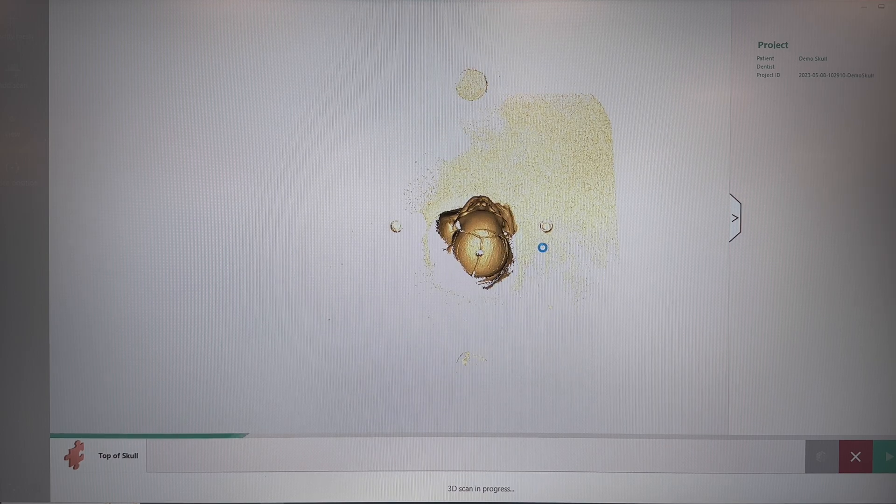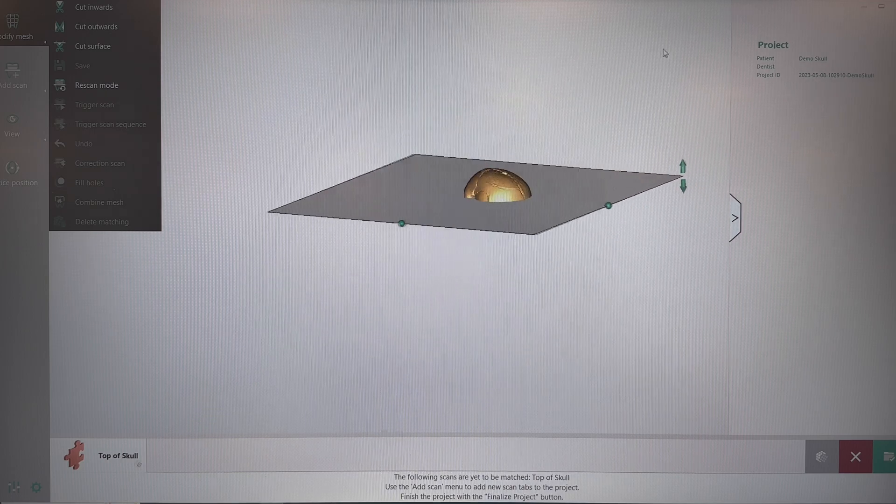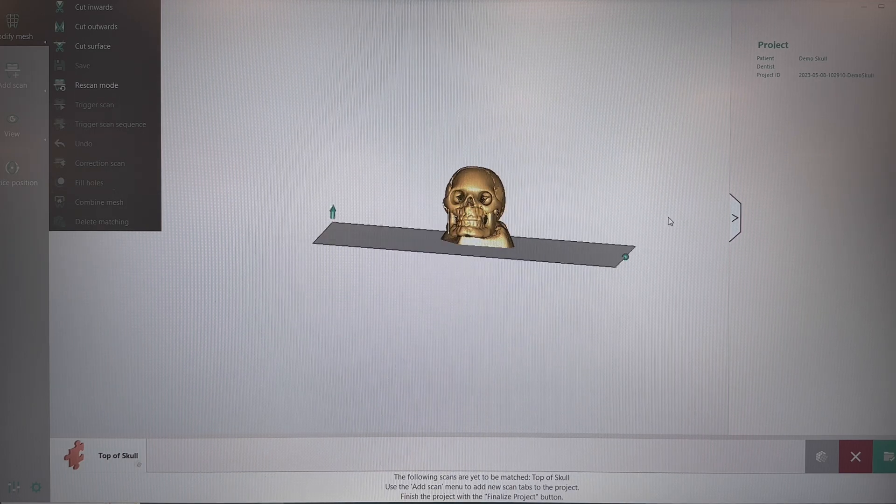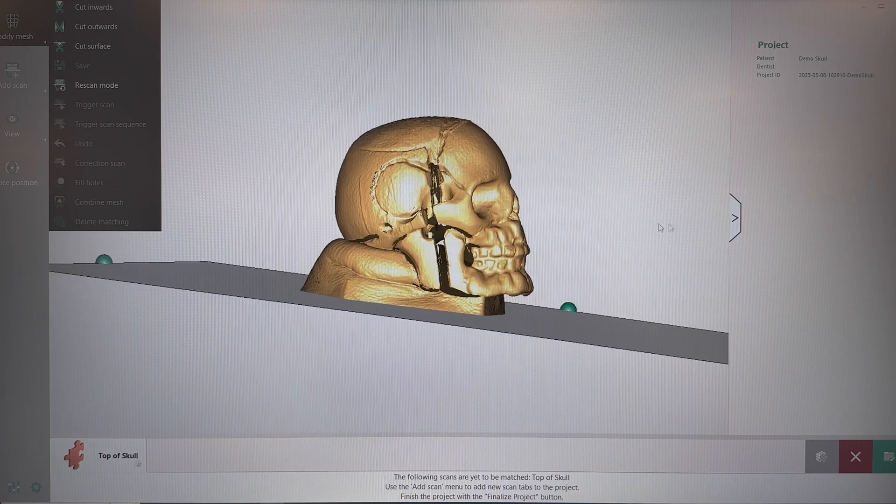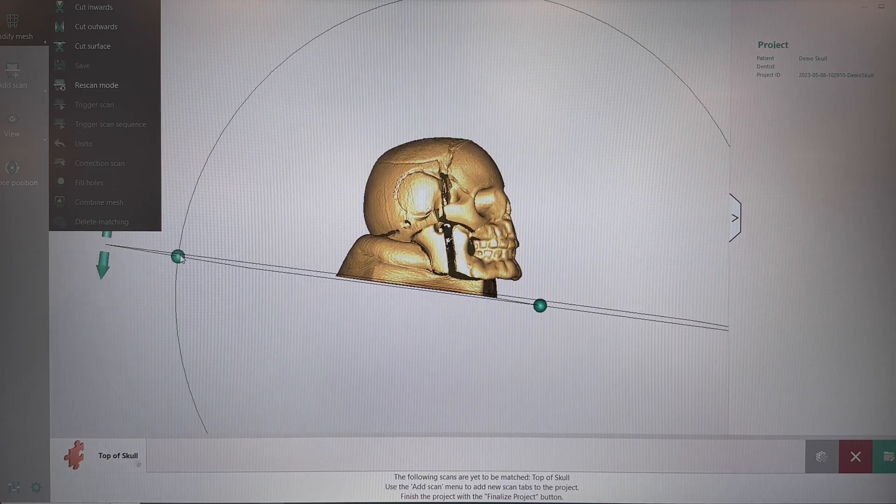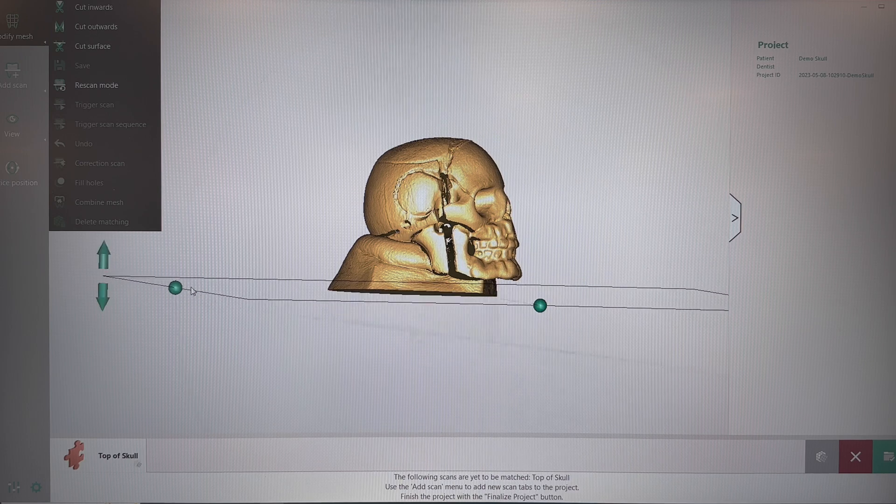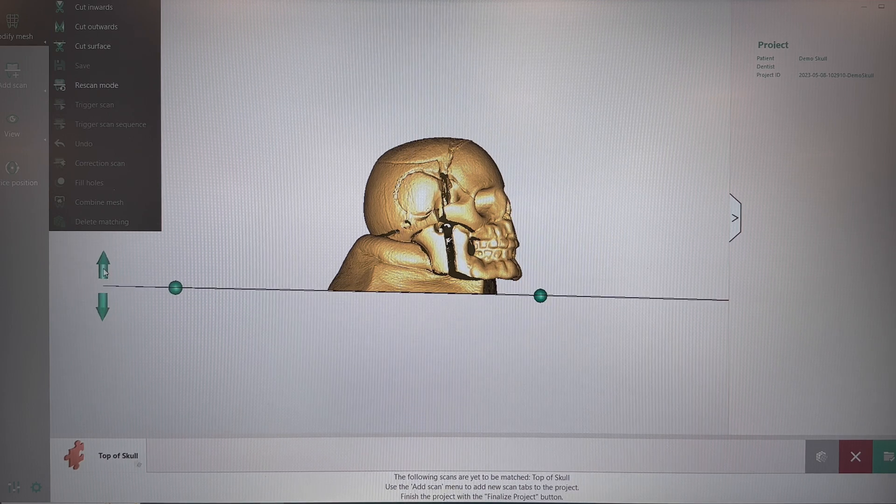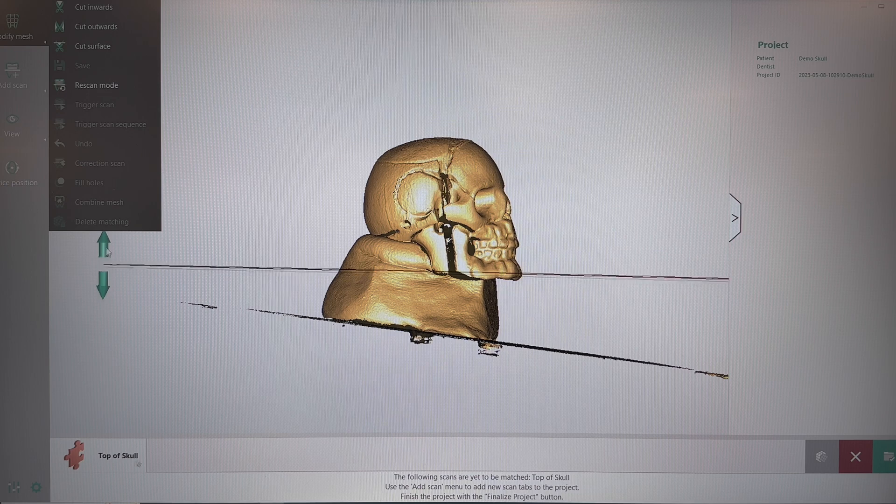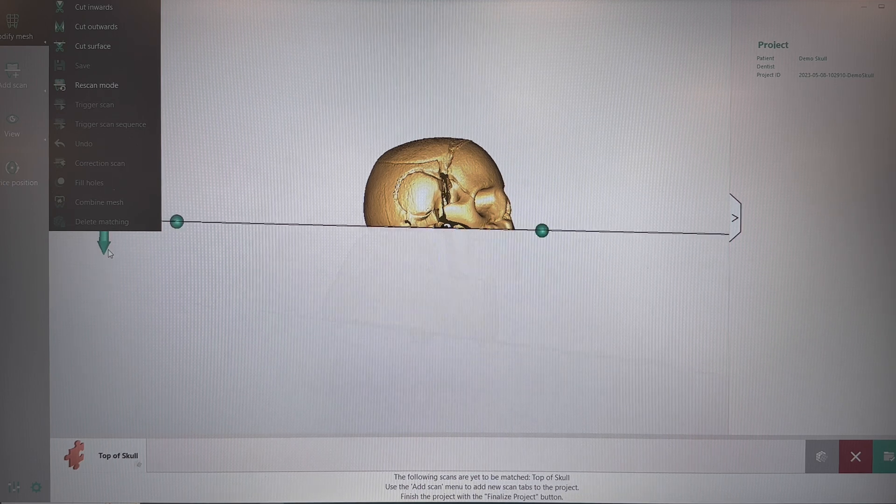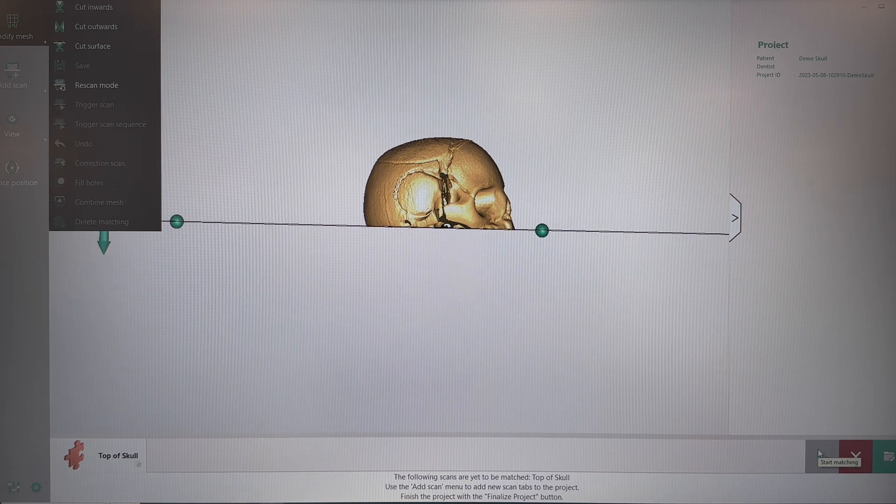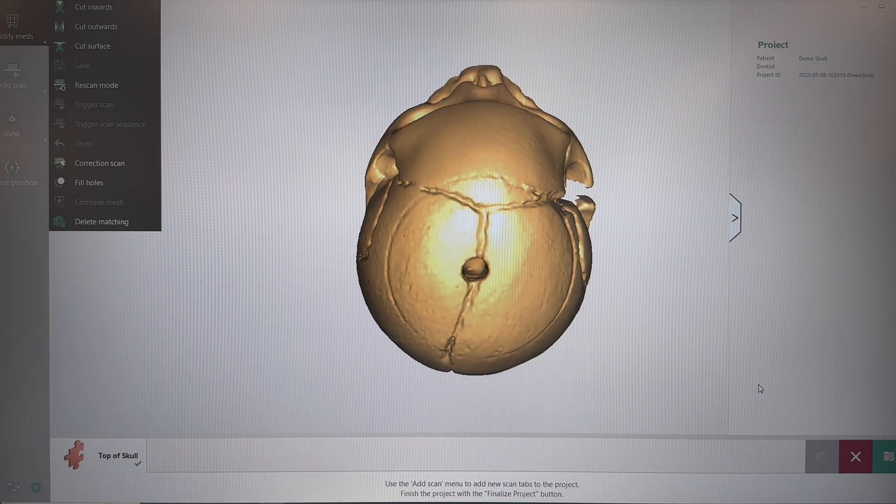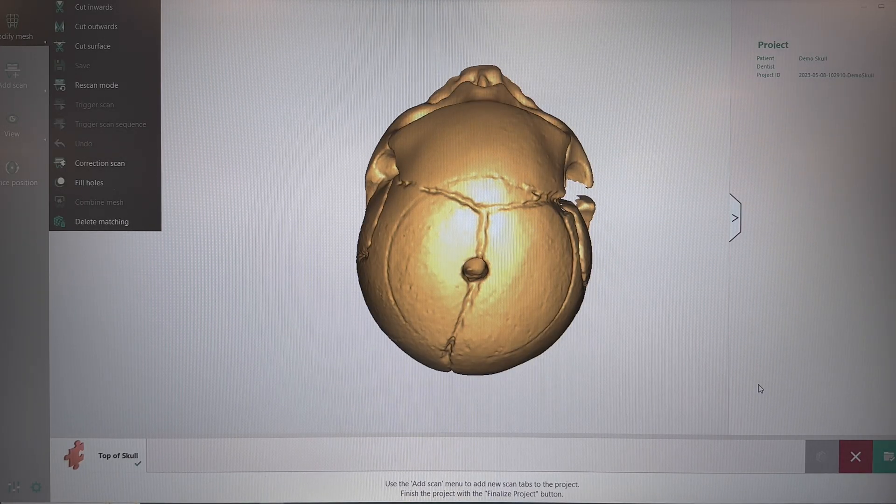Once the scanning is complete, we're going to need to trim the object. What I like to do is get the object horizontal with me, and then I'm going to use the two balls on the trimming plate to make it horizontal as well, and then use the up and down arrow to cut it. I like to get about half of the model away, get the putty out of there. And when you're done, in the lower right, click the Matching button. This is going to give us the final scan of the top of it.